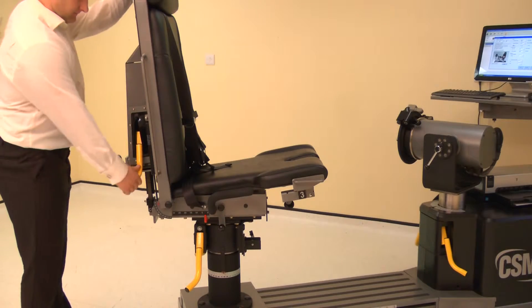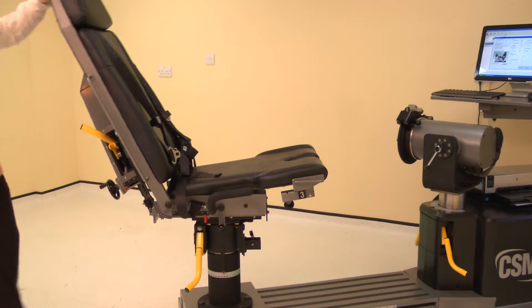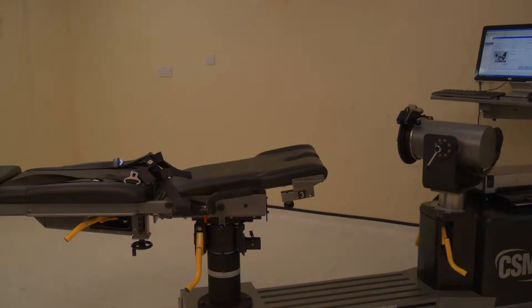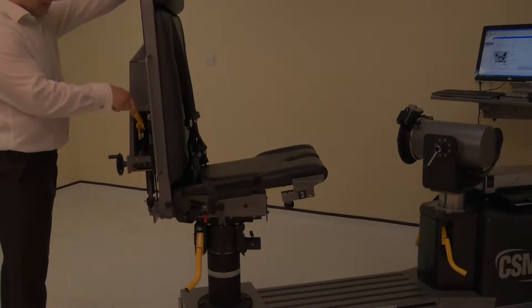To set the chair back angle, lift a locking handle and adjust the chair back. Adjust the chair back angle to 85 degrees. Ensure both locking handles are pushed down to secure.